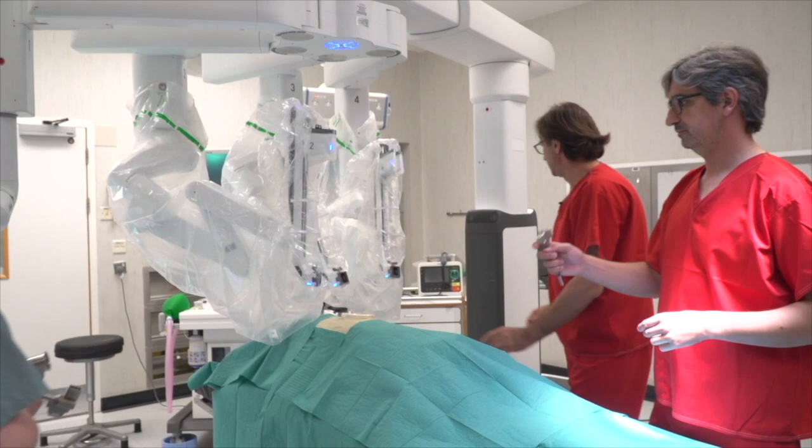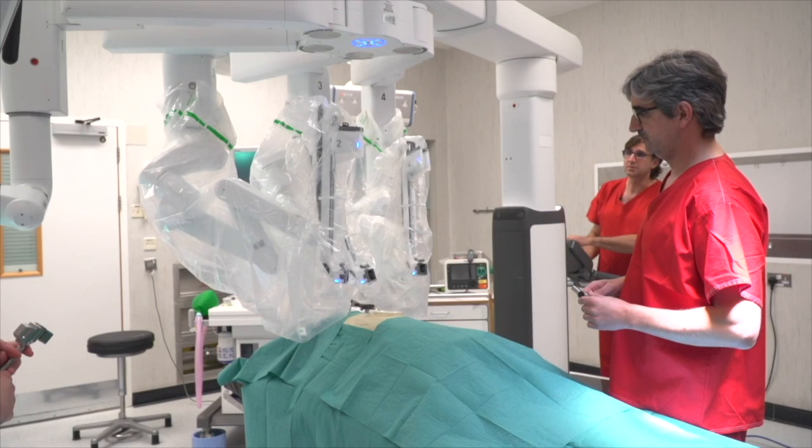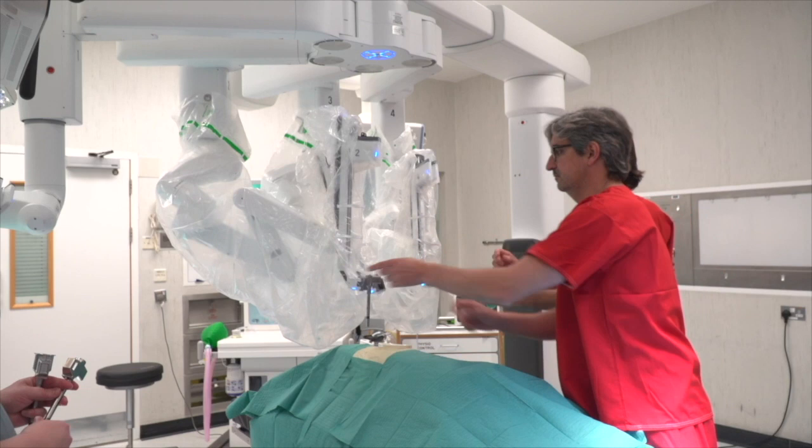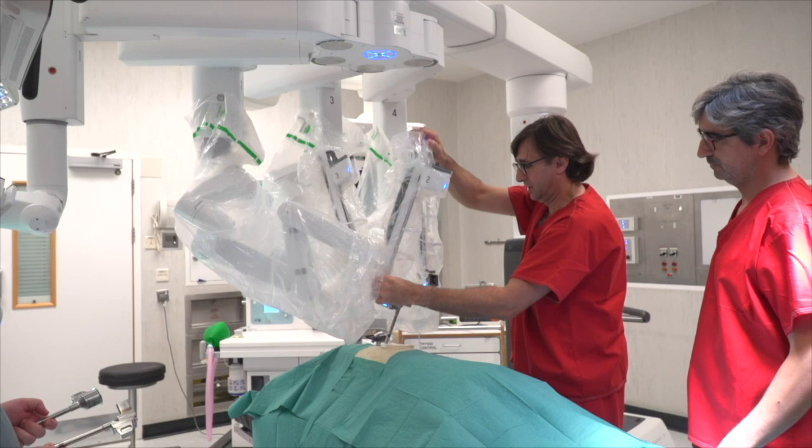Maybe a little height, boom height. Let's enable joystick, because for the stapling, when I take out the stapler, there must be some space. Install the endoscope for targeting. No targeting, never. We don't do targeting. It's one of the things that make this faster.